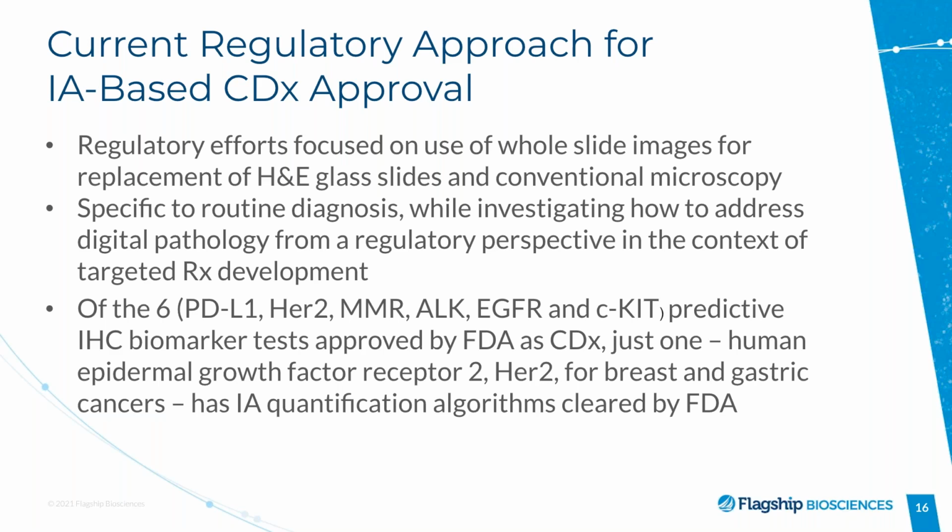It can tell you where the positive lymphocytes are in relation to the tumor nest, where the macrophages are in relation to the tumor nest, and so on. I could actually go on forever. So in summary, these digital assays are not only logistically more useful, but they can also be a lot more informative.